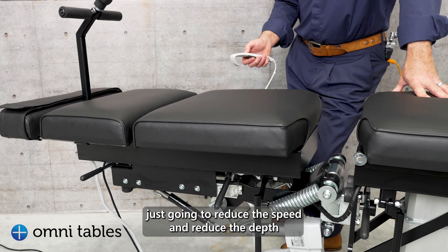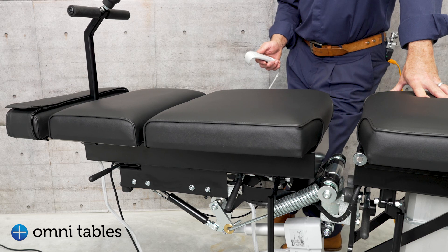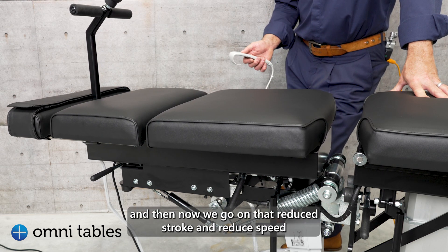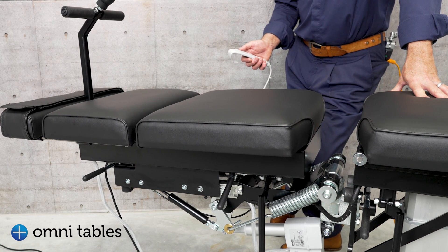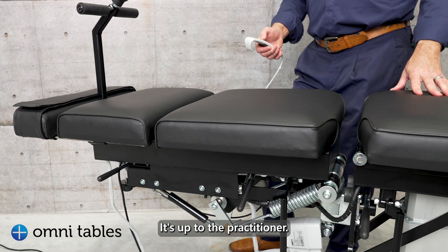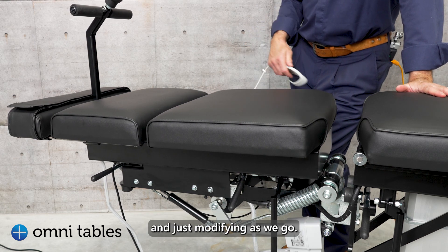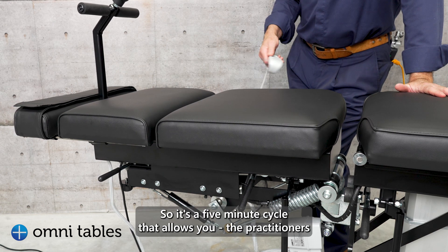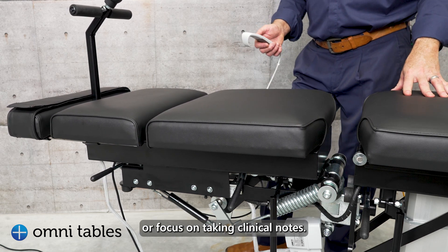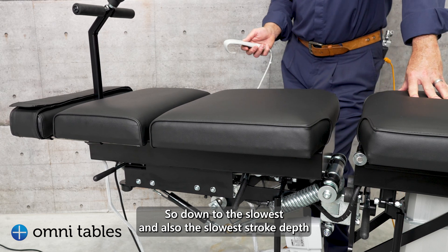I'm now going to reduce the speed and reduce the depth on the fly. It comes back to its normal setting, then we go on that reduced stroke and reduced speed. All of these are interchangeable — you can have the full depth with a slow speed, or the full speed with a slow depth. It's up to the practitioner. It's a five-minute cycle — it allows practitioners to set the client up and get them working while you work on another area or focus on taking clinical notes. I'm going to come down to the slowest setting for the long axis distraction — slowest speed and the slowest stroke depth.